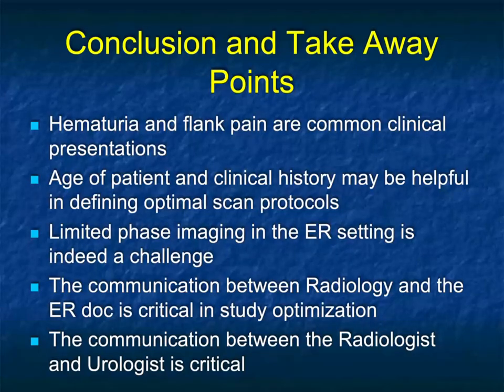One of the challenges in reading films in the ER, it's often a single-phase study because it's rule out abdominal pain or rule out anything, and you really don't have a great history. So it is a little bit challenging. Some patients may need to be rescanned. The communication between radiology and the ER docs is critical. We need the right history so that we can do the right study for each and every patient.